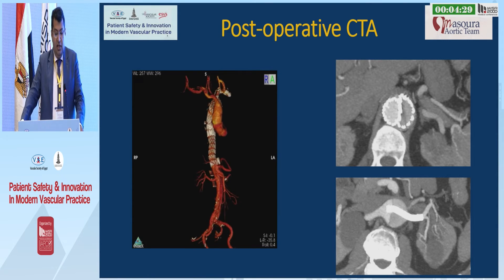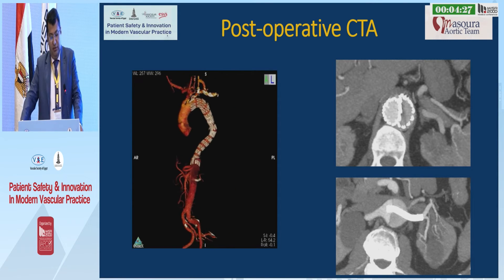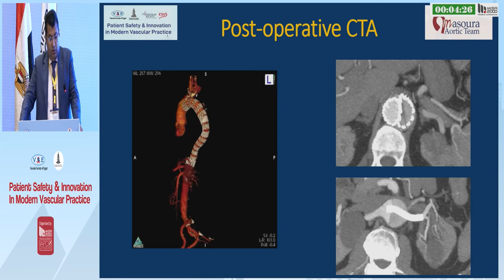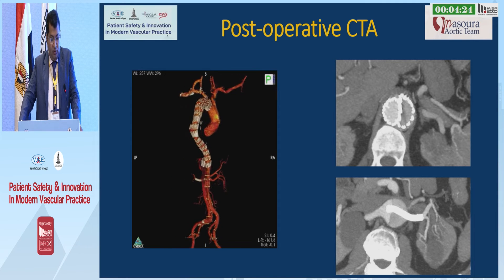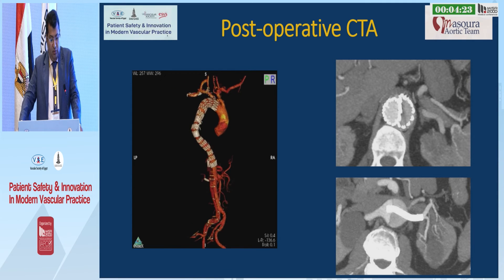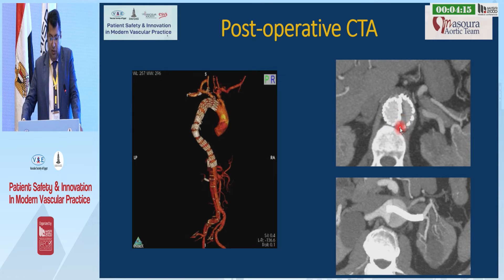One-month postoperative CTA shows complete disappearance of flow in the thoracic part of the false lumen. There is increase in the diameter of the true lumen and decrease in the diameter of the false lumen at the level of the celiac axis, and good opacification of the stent and left renal artery.